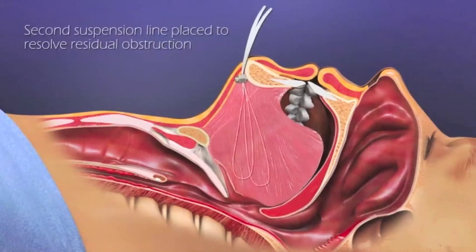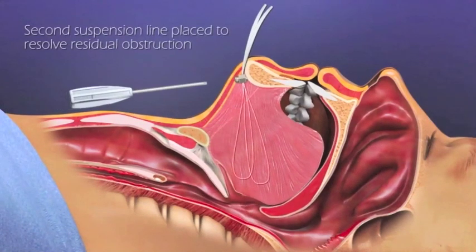If residual airway obstruction remains, a second loop can be placed and advanced to resolve this.